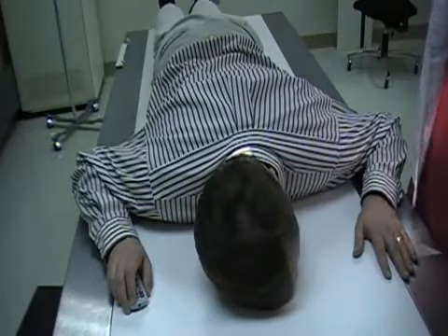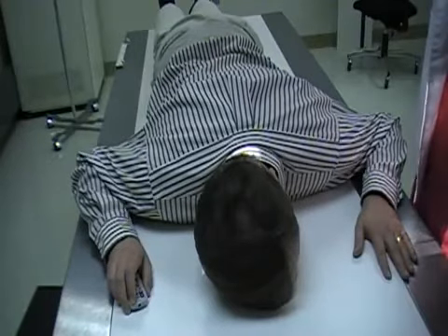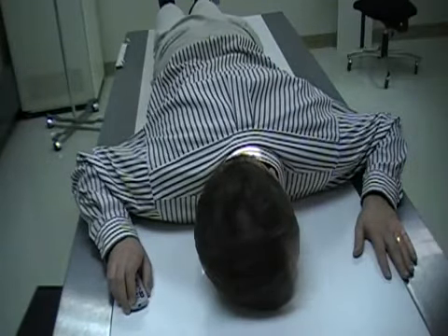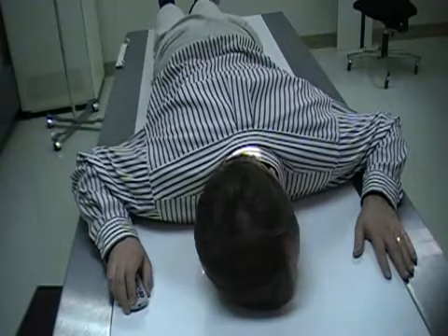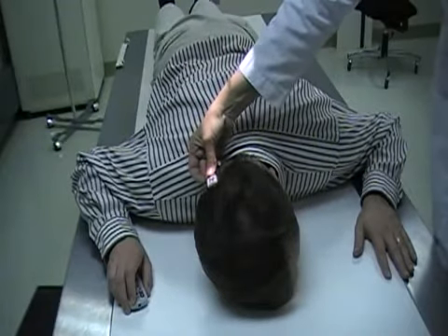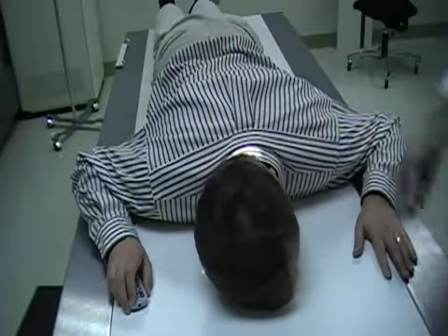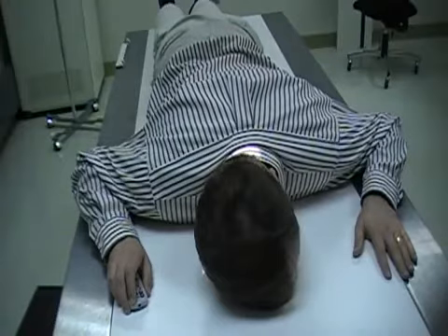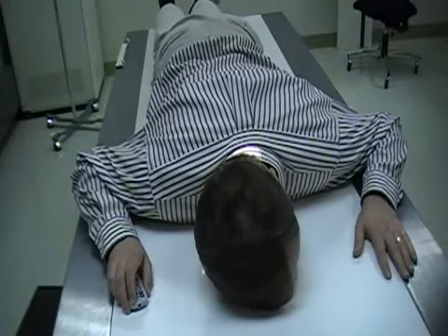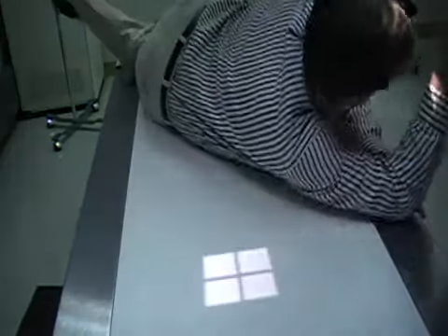Collimate tight again for this. Because it is the right side that's down, we're going to place our right marker in the outer corner there. Now, if your patient cannot be in a prone position, you can do the reverse Stenvers, which is known as the Arcelin method.